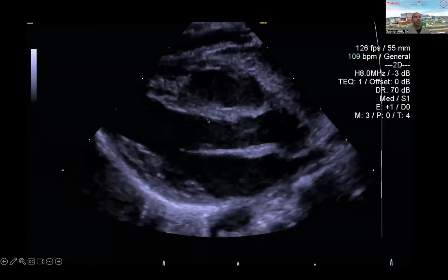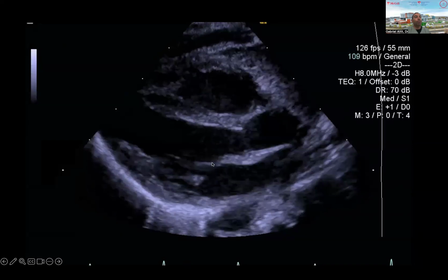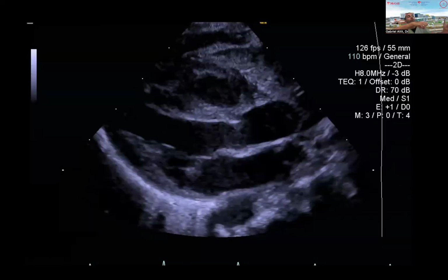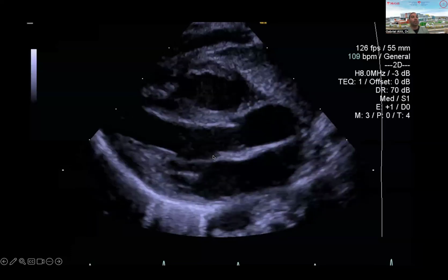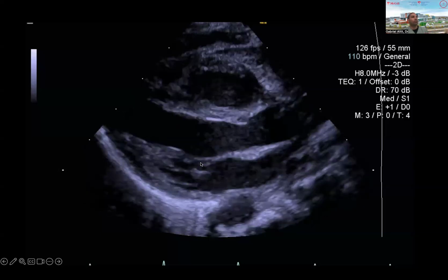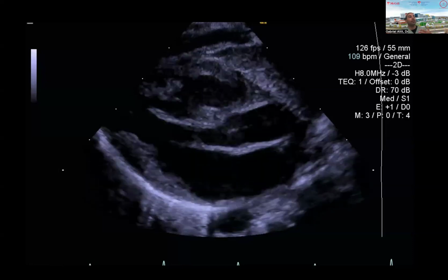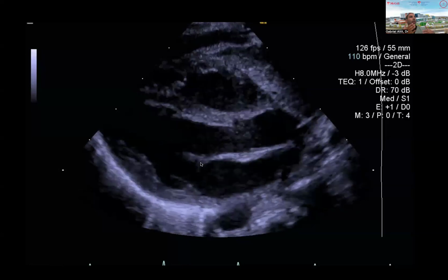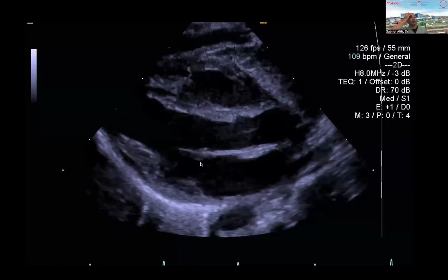When you start having an infant with hypertrophic cardiomyopathy or septal hypertrophy, during the contraction it pulls a bit of the base, like everything, towards the aorta. And sometimes this mitral valve will have a motion that comes in front of the aortic valve. We call this systolic anterior motion of the mitral valve, and this can obstruct the outflow tract. And these patients can be very sick, and so part of their treatment is obviously to relax them. So esmolol, give more fluid, making sure that they're not depleted.